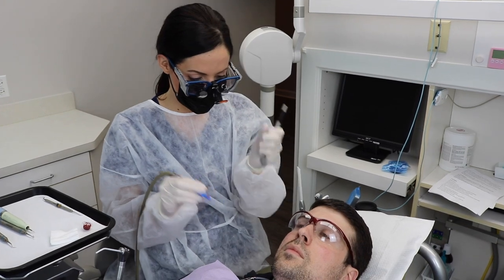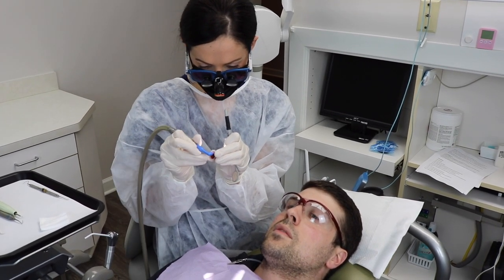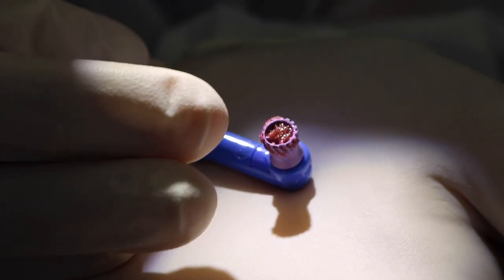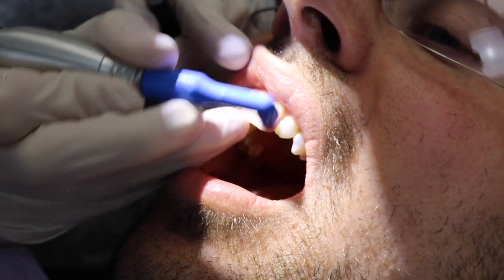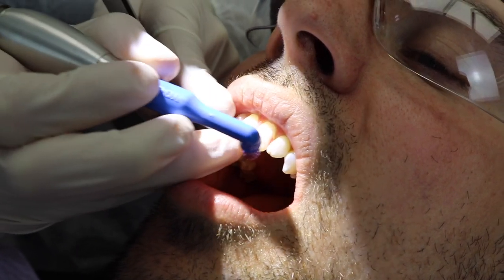Here's what I do: I don't put too much polish. I know a lot of people complain polish gets everywhere. I fill the cup — I've seen some people put like a mountain of it in there — you don't need that much. What I do is I kind of wipe it on the teeth first. That way it's kind of there already, instead of when you just start and it flies everywhere.